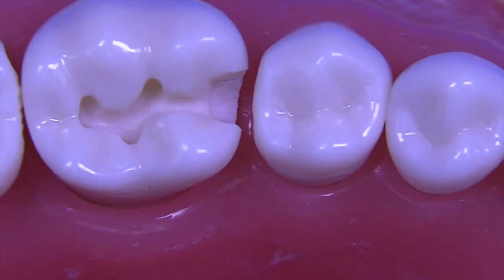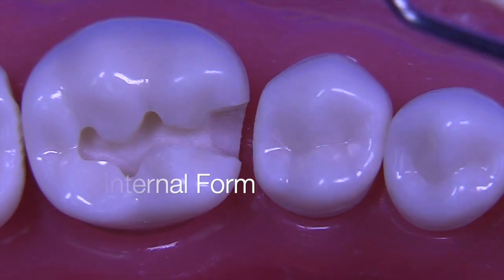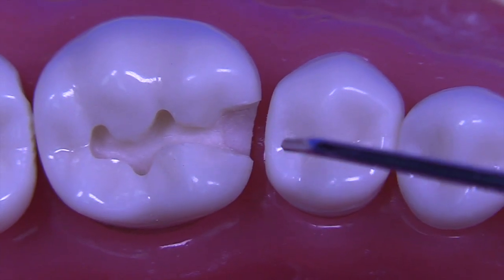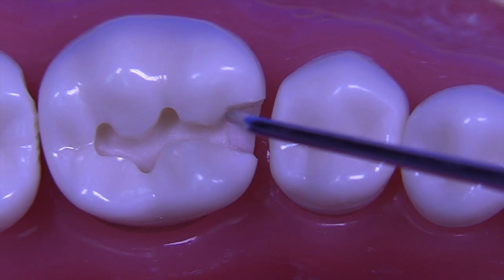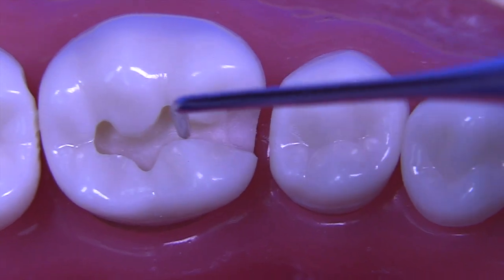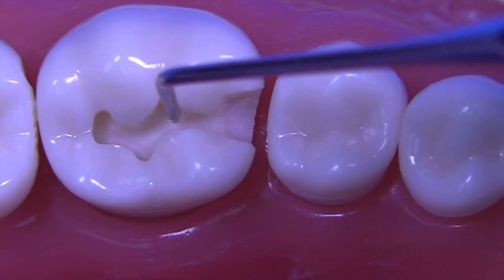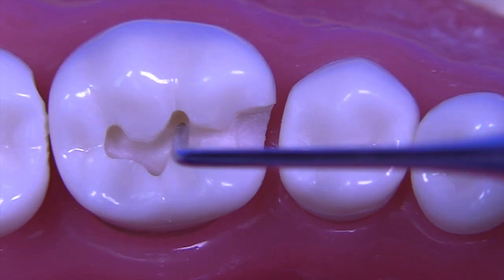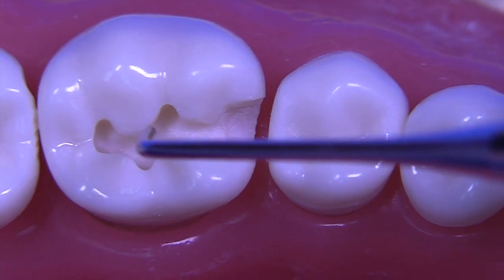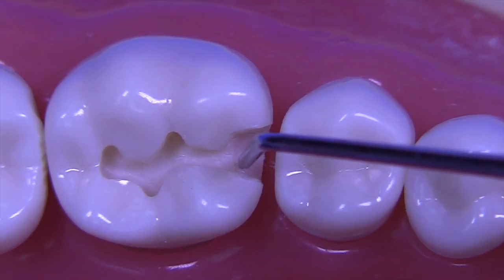So I think overall, in terms of your internal form, the only things that I would criticize would be the depth of your axial wall and your convergence error, divergence error that you had made on the occlusal, where you had slipped the burr over towards the facial when your burr actually should have been leaning somewhat towards the lingual. Okay? And there is some irregularities inside.